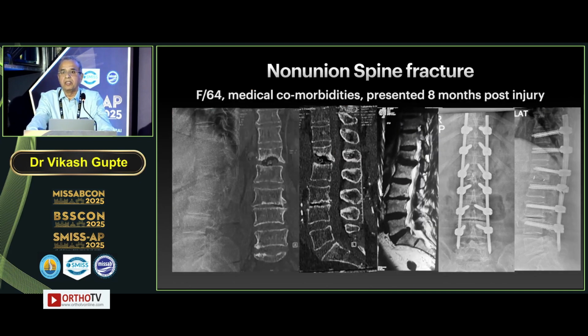What about non-union spine fractures? Now this patient with medical comorbidities, hypertensive, diabetic, had septicemia for which she was admitted in ICU for almost 1.5 months. She was treated there and recovered, but in between her spine fracture was ignored. So this is the position we saw after 8 months. For that, I did minimal invasive TLIF with percutaneous pedicle screw fixation.